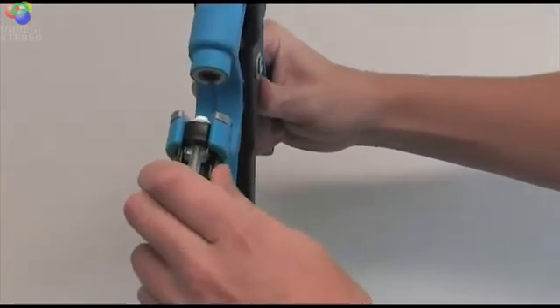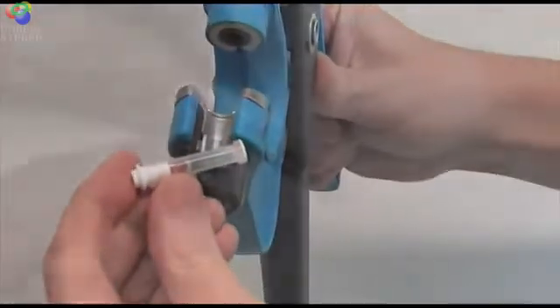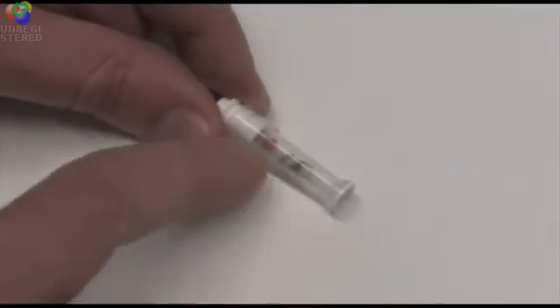Next, you can remove the sample by twisting the black tube retainer at the bottom and taking it out. You should be able to see an obvious sample inside the tube as well as a red plunger.